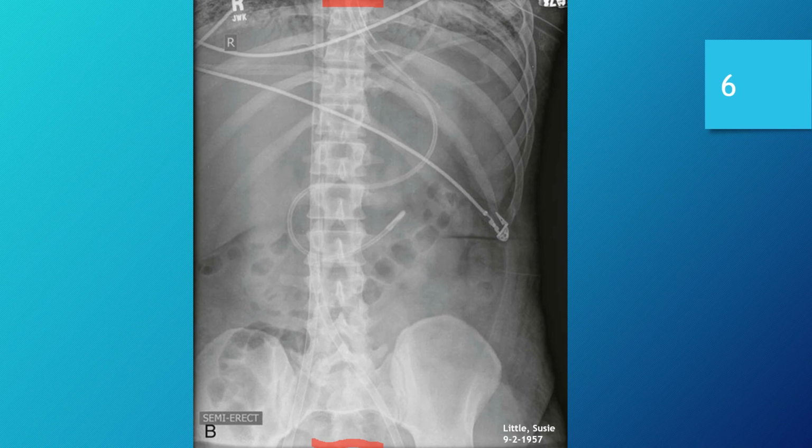So we know that for a supine image of the abdomen, it must include the bladder in order to be fully diagnostic. Now, the aim for this particular image when it was taken may not have been just strictly a routine KUB. In fact, I think it's pretty safe to assume that it was not. However, we can still critique this image on the basis of what is required for a complete abdominal study. And this does not have it.